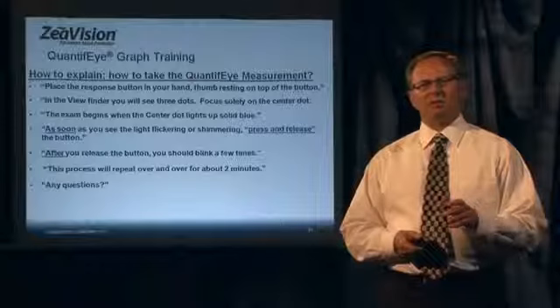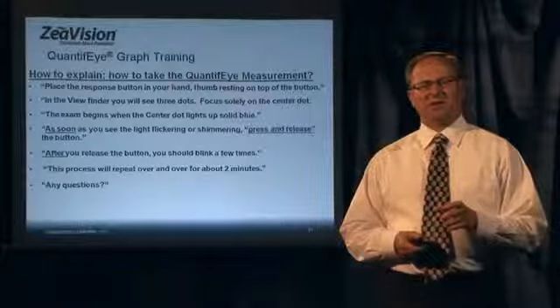You know, oftentimes I get the question, what is the reliability of the scores that come from this equipment, and why do sometimes I see different scores for the same patient? So let's have a discussion about that.